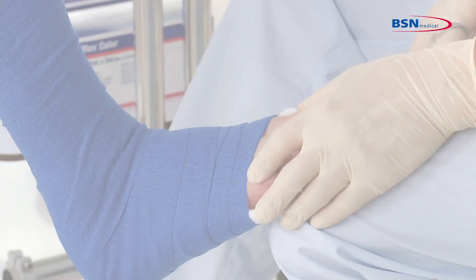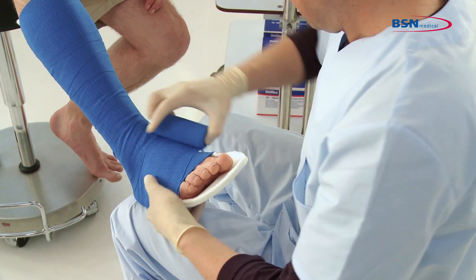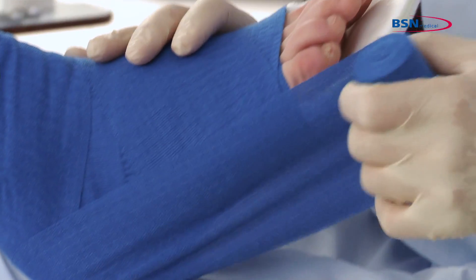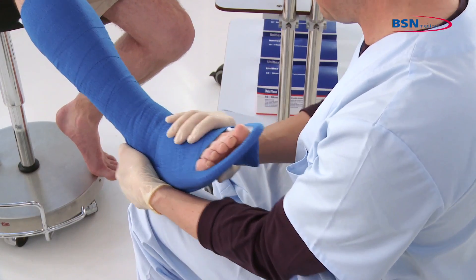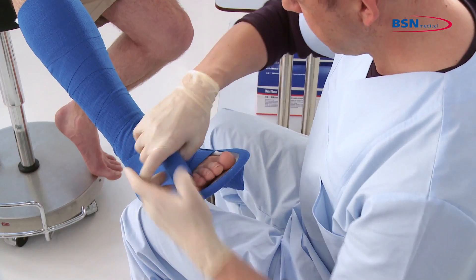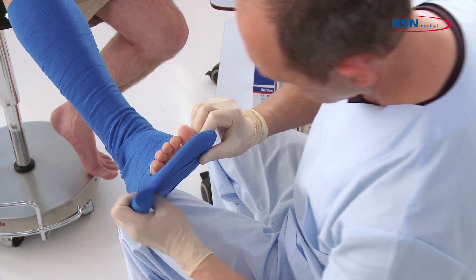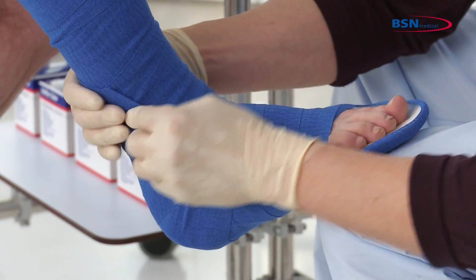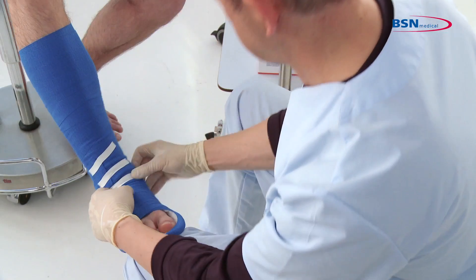Then take a third bandage and wrap around the splint and foot. Finish the application by fixating the bandage with a tape or hook and loop fastener.